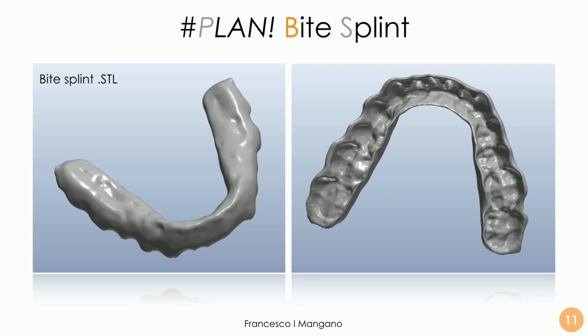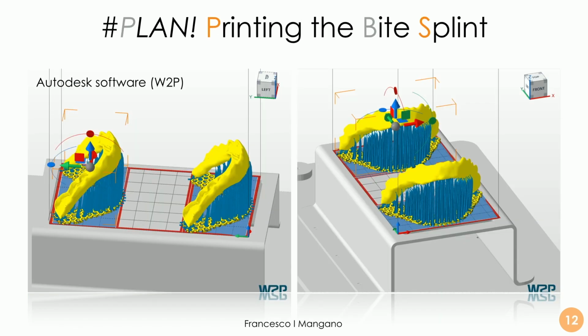It's very important to control the quality of these files before going to the printing machine, to the 3D printer.